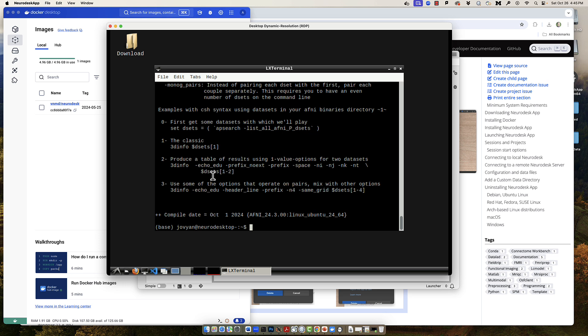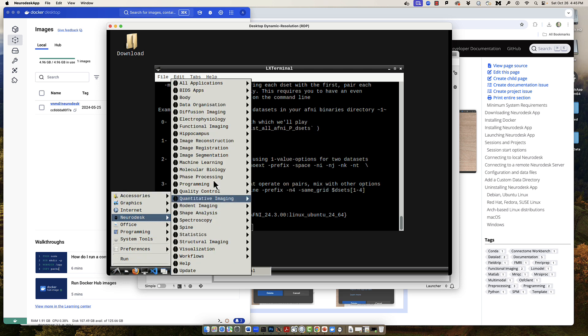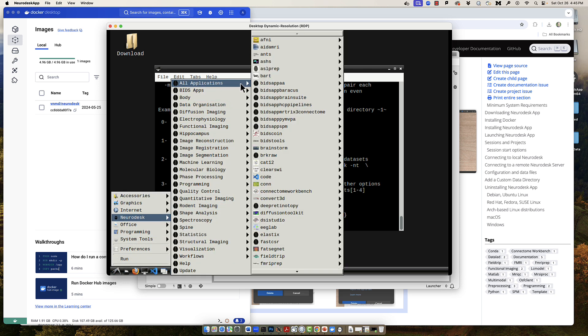Now that you've seen the basics of how Neurodesk works, you'll probably want to sample the other options as well. There are many libraries available which almost exhaustively cover the range of imaging analysis software available. You can see the full suite by clicking on the icon at the extreme lower left of the virtual desktop and then selecting Neurodesk and All Applications.